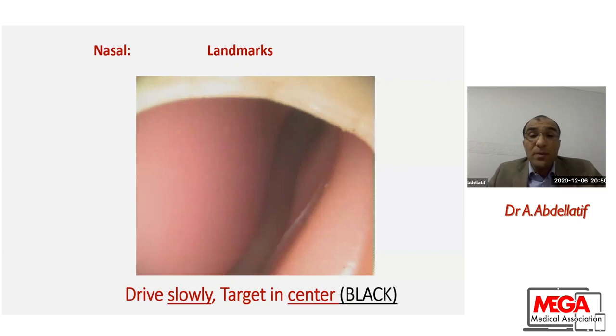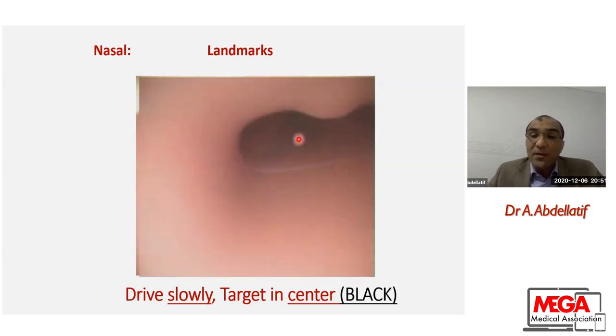Okay, if the nasal route, I have to drive slowly also, and the nasal route is a very narrow space, so liability of trauma and bleeding is much more than the oral route. So I have to be very cautious before going inside. I have to look for the black area, because the black area is the air. So I have to put the black area in the center, then go.